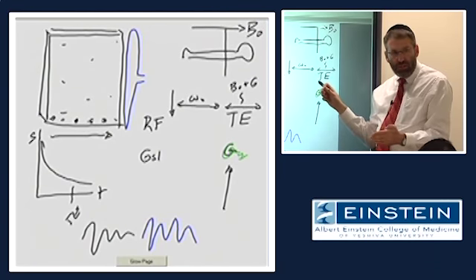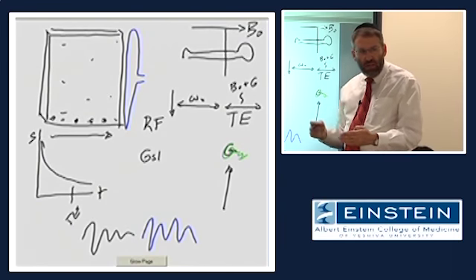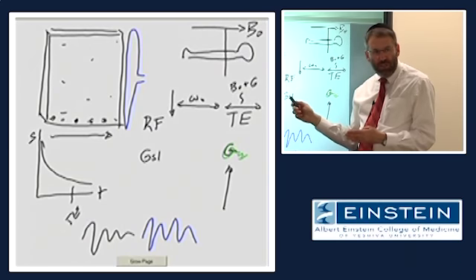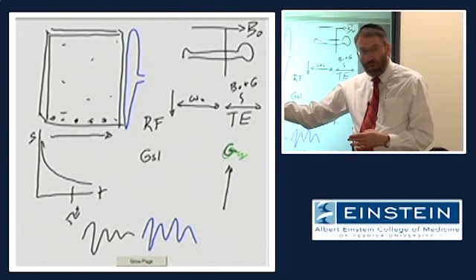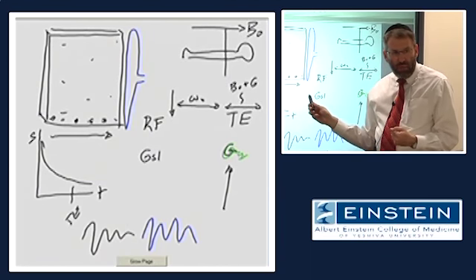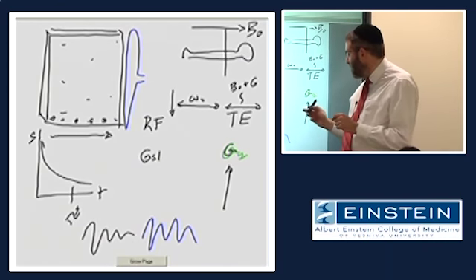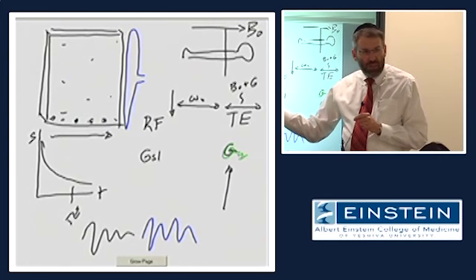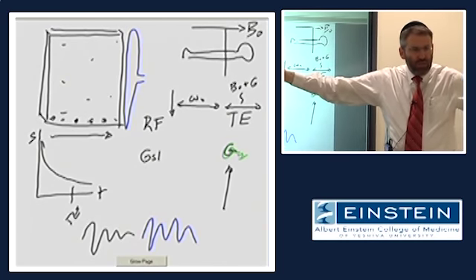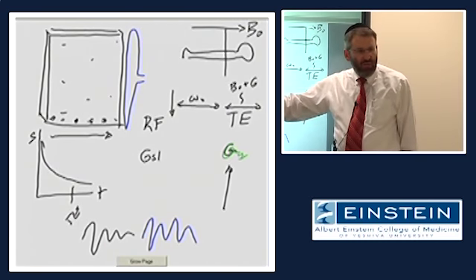During that measurement of signal, we turn on a gradient magnetic field in a direction that is perpendicular to the direction of slice selection. It is along this left-right dimension in the slice. Okay? Now keep in mind, however, it's not true to say that this gradient magnetic field is only applied to the slice. The gradient magnetic field has its effect throughout the bore of the scanner. That's only where I see it. But it only counts over here because we only have signal over here.